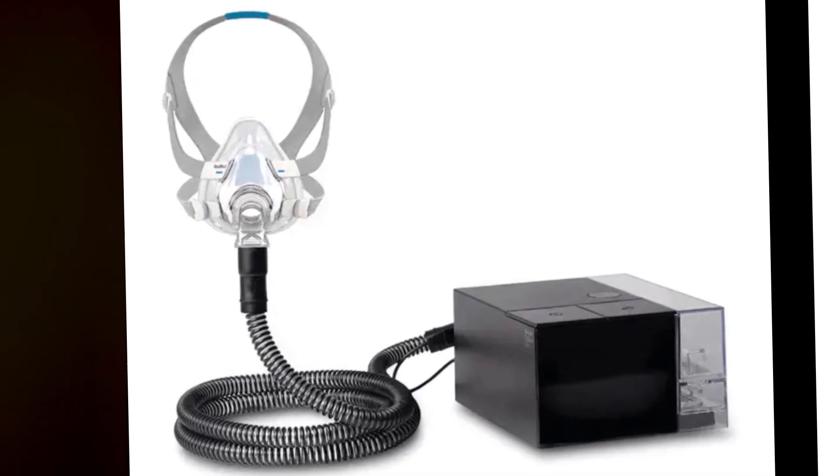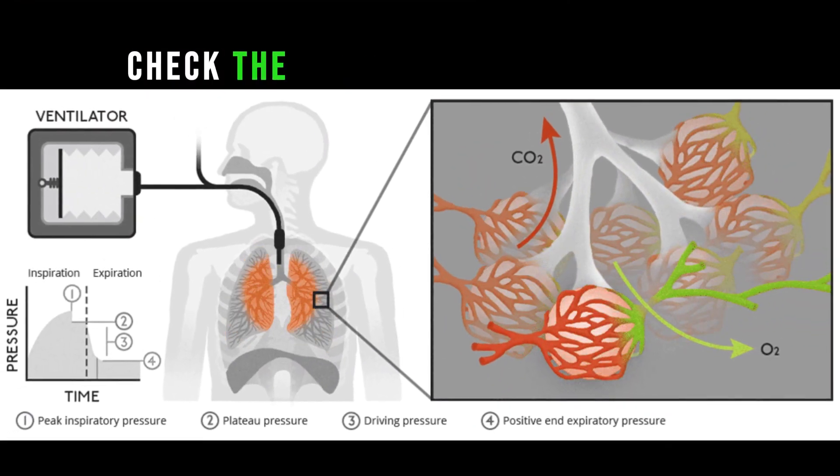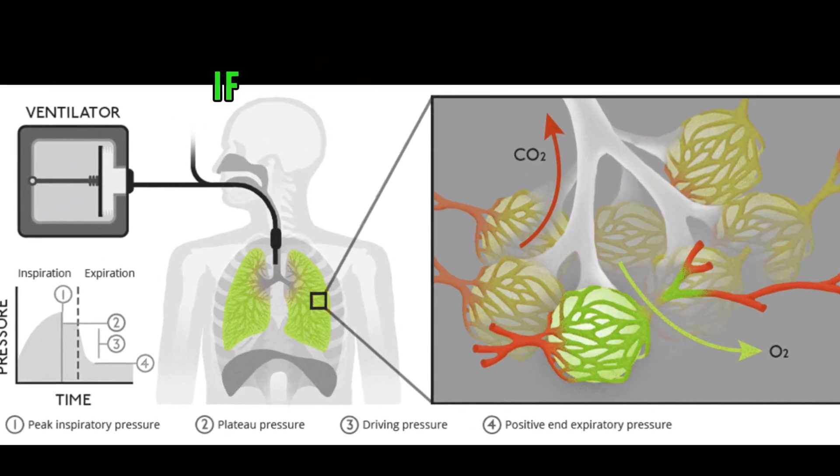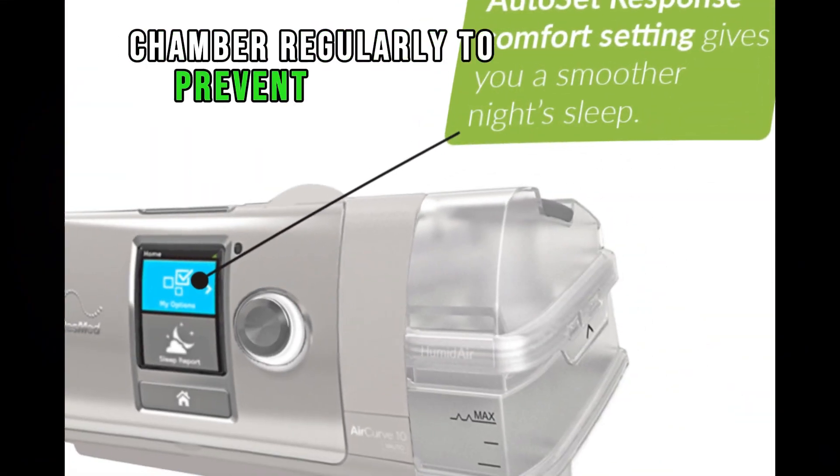Humidification issues, if applicable. If the BiPAP machine has a humidifier, check the water level and refill if necessary. Clean the humidifier chamber regularly to prevent mineral deposits.